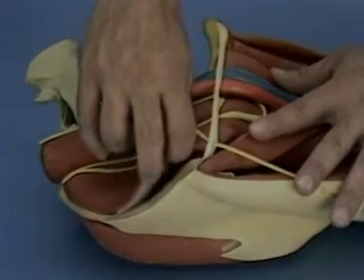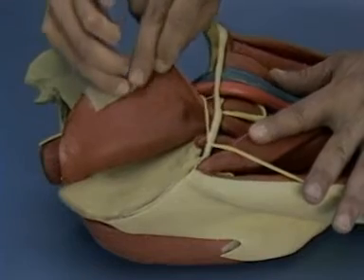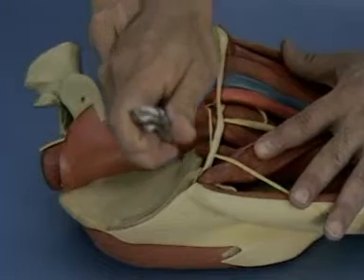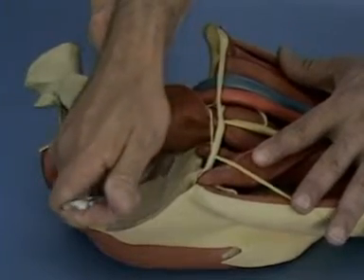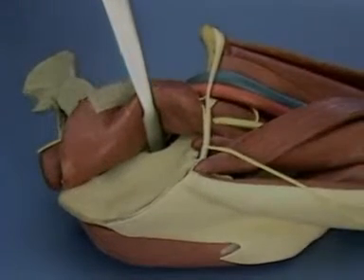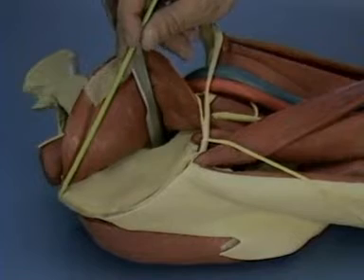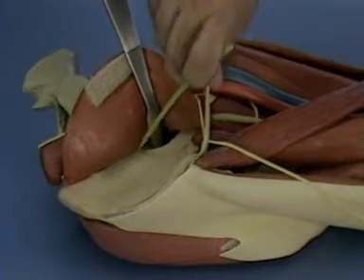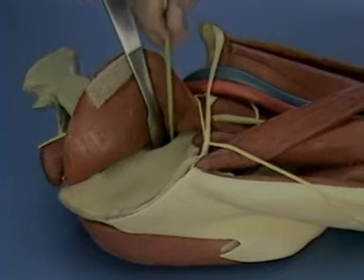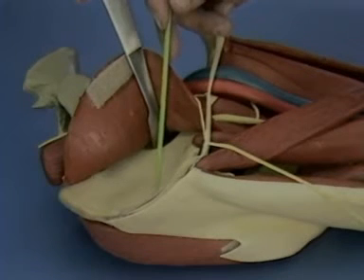The first window of the ilioinguinal is opened by reflecting the ilioopsoas muscle and the abdominals in a medial direction. A Homan retractor is placed with a tip over the pelvic brim. The entire internal iliac fossa is now exposed, along with the anterior sacroiliac joint, the upper portion of the pelvic brim, and the upper portion of the anterior column.